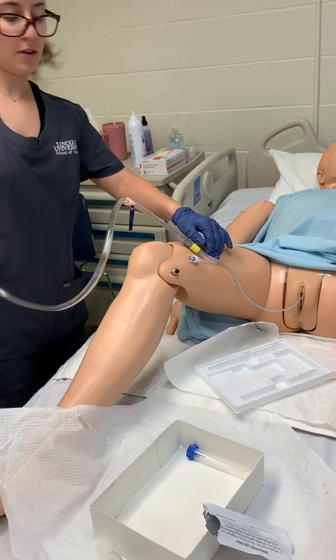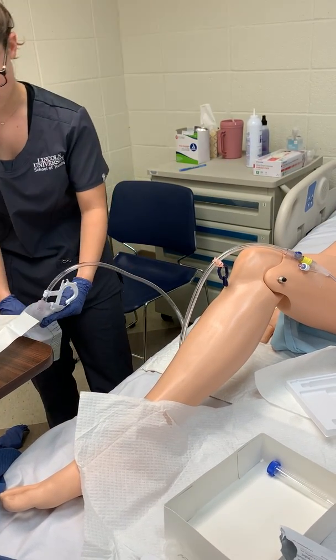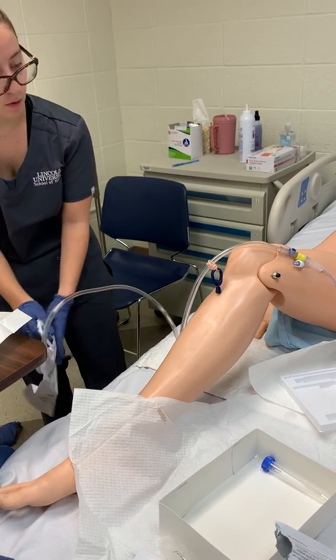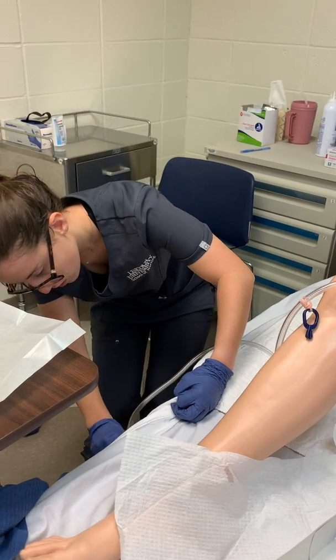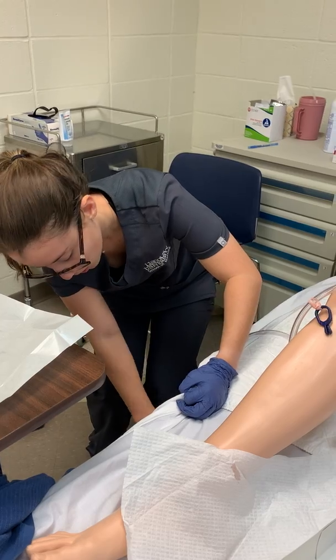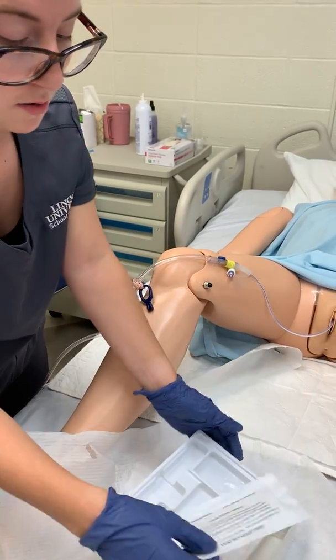And when I'm taking my catheter bag out, I just want to make sure there's no major loops in it while I'm hanging it. And I'm always going to hang it below my patient on a non-movable part of the bed. So now I can just go ahead and clean this all up.